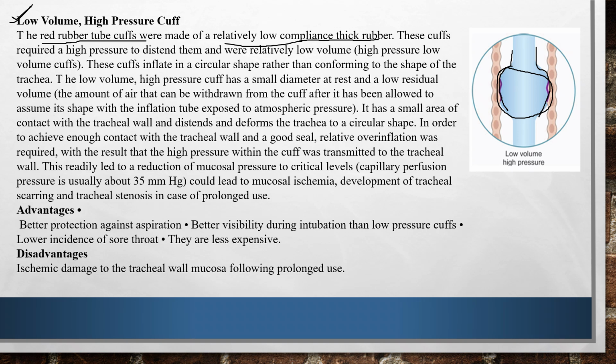So the advantages, as I have already told you, is that it protects against aspiration. As it contains low volume but the pressure is high, there is a very decreased chance of leaking fluid into the lungs, so it provides a protective barrier against aspiration.